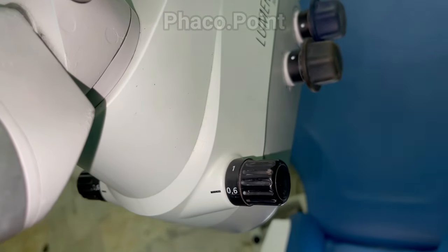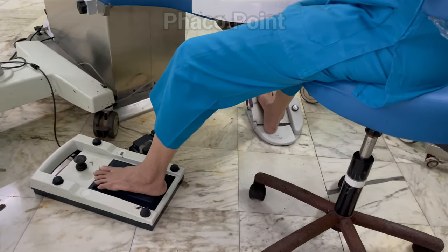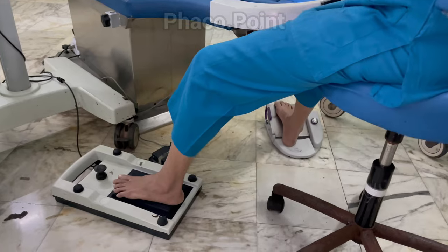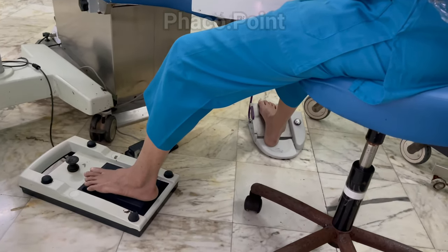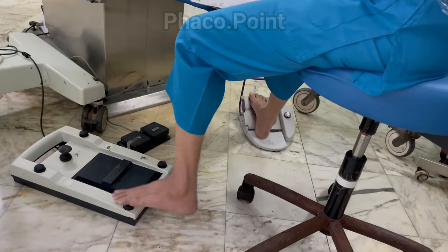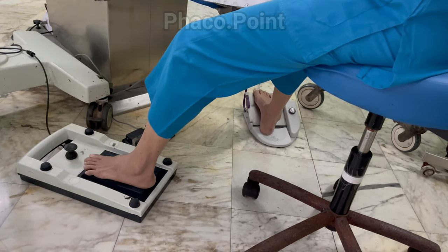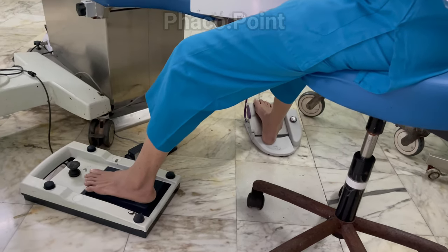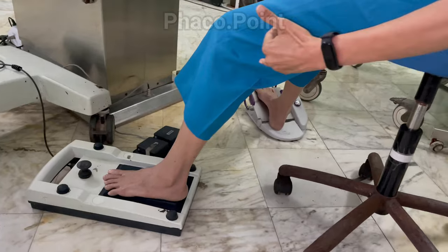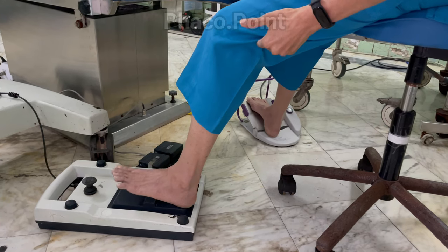Now we look at the surgeon's comfort while sitting, with respect to the foot pedals and the microscope, and the sequence with which each needs to be adjusted. Conventionally, most people have the phaco foot pedal on the right and the microscope foot pedal on the left. It's important that the surgeon orients themselves with the microscope foot pedal — knowing the on/off button as well as the fine and coarse focus controls. The placement of the foot pedal relative to the knee should give an angle greater than 90 degrees.